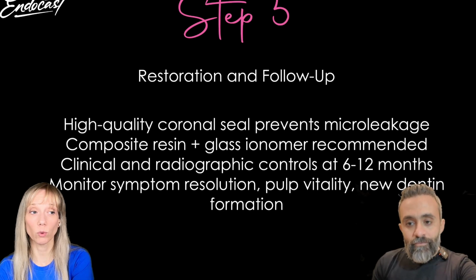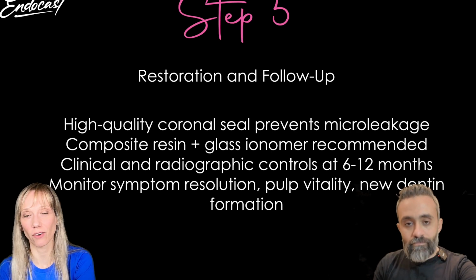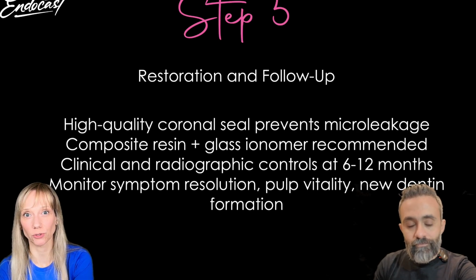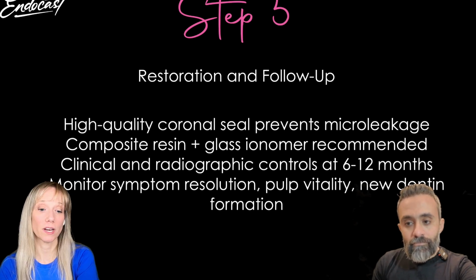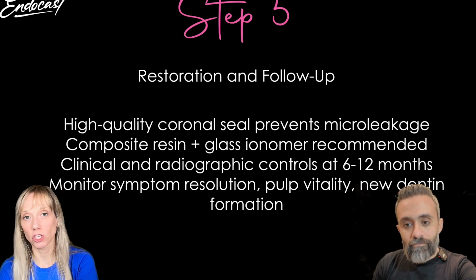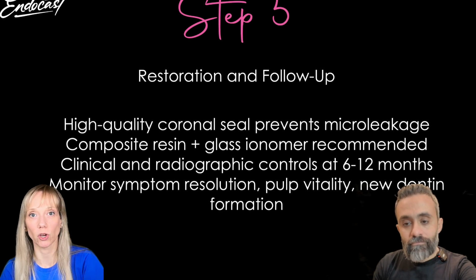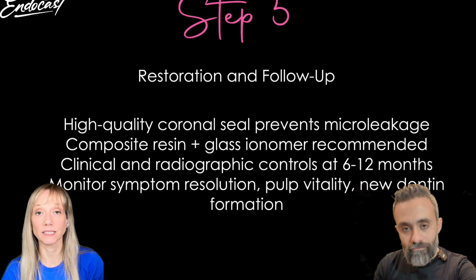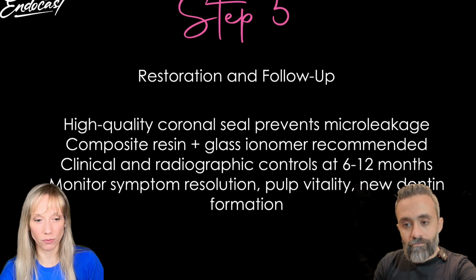So this is very important, and why we use MTA, besides, of course, all the biological advantages of the calcium silicate cements. We always said immediate restoration, immediate sealing of that area, because we don't want bacteria to be able to get in there and compromise all what we did with our treatment. And so a high quality coronal seal is mandatory. So if you can use composite, use composite. You can also use some mix between composite and glass ionomer, but still do not put provisional materials. Otherwise, you will lose all what you did before.